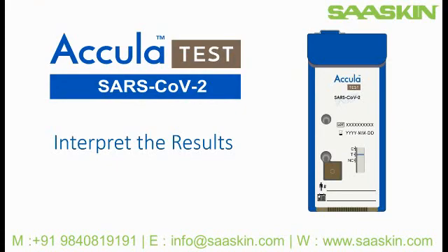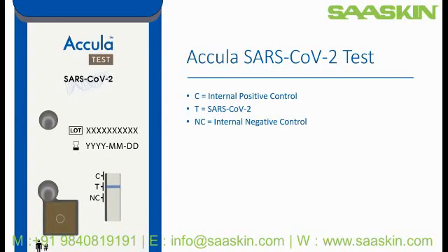Welcome to this short video on interpreting the Acula SARS-CoV-2 test results. Results are interpreted visually by assessing the absence or presence of a blue test line. The lines will appear at three line positions: C, T, and NC. The C position is for the positive control, T is the test line for SARS-CoV-2, and NC is the negative control. The test shown here displays the presence of a test line at the T position, the position for SARS-CoV-2.